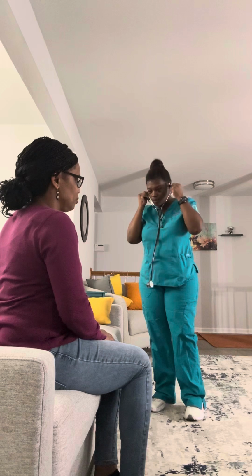So next I'm going to listen to your apical pulse, okay? I will be listening for 1 full minute. I am going to assess the rate and also the rhythm. I am listening for the lub-a-dub sound, because if I don't hear the lub-a-dub sound, then something is abnormal, and I would have to document and let the doctor know as well, okay? I'll be listening for a whole minute, and then I'll get the rate and let you know what it is. I want to let you know where it's located, which is at your 5th intercostal space, okay?